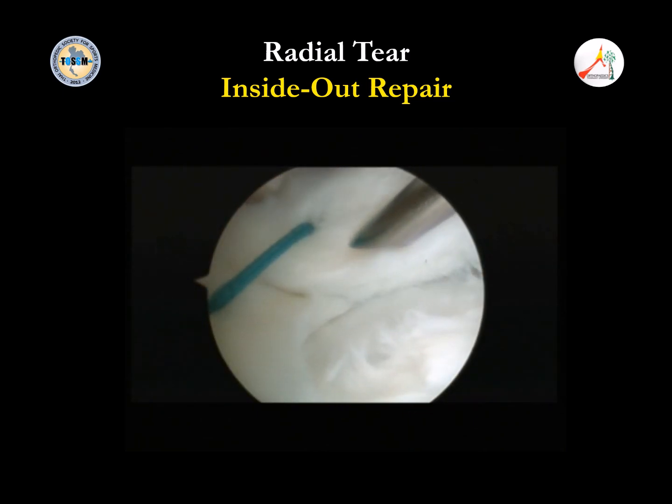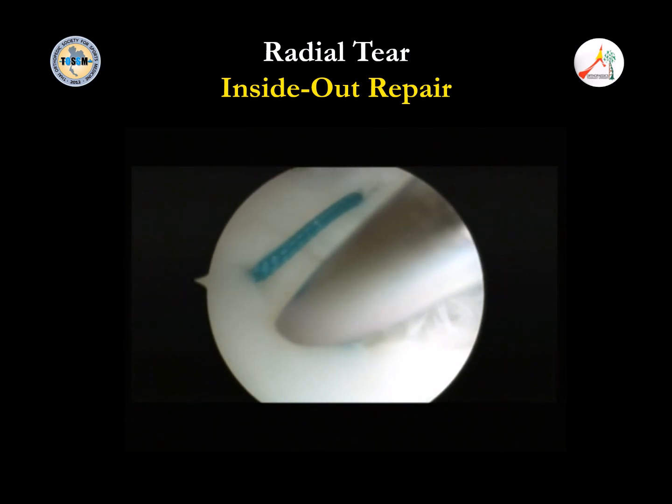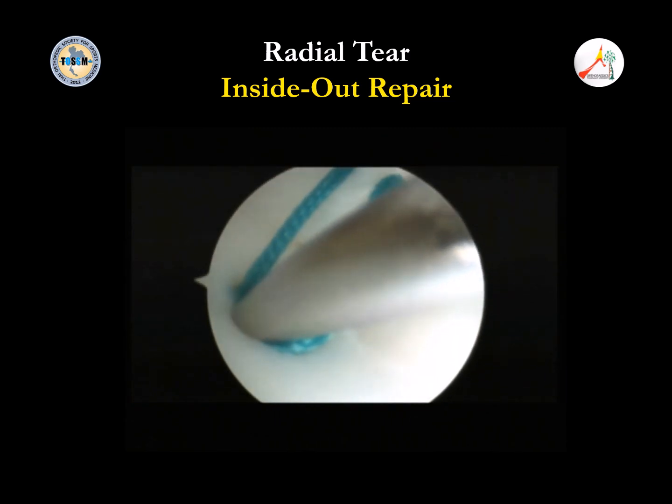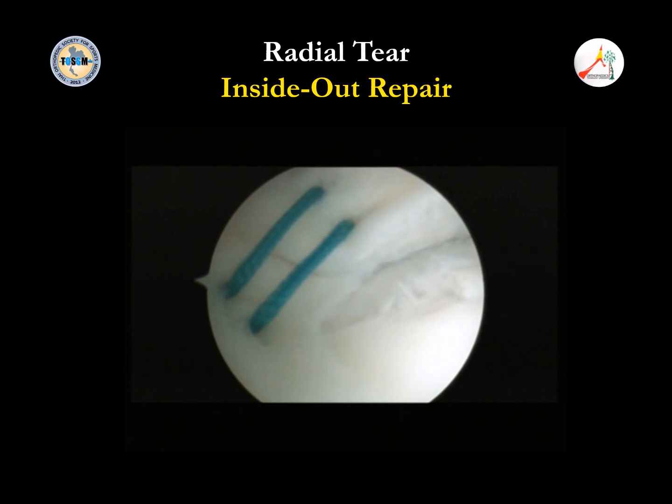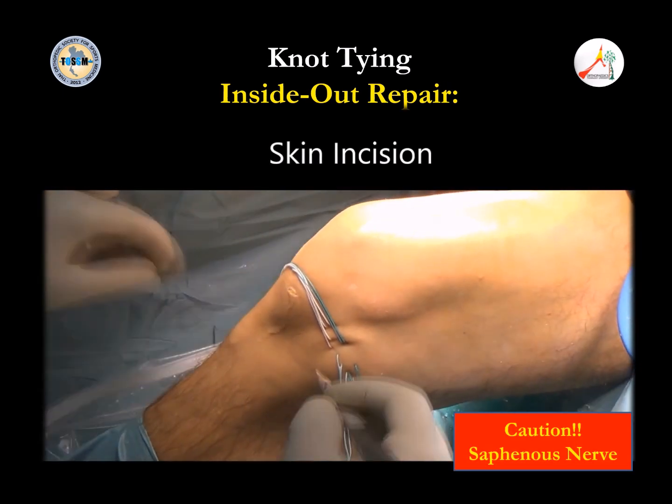So for the oblique tear or the radial tear, I prefer to use inside out, because sometimes at the body when you put the meniscus fast fix, the patient can feel the impact. So that's why I prefer the inside out repair. But your stitch has to be a little bit big, because if you get too close, you cut through. This horizontal mattress stitch is parallel to the fiber, so it can cut through the tissue. So keep in mind, make it a little big.